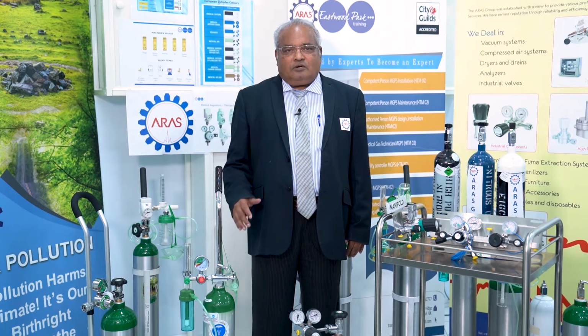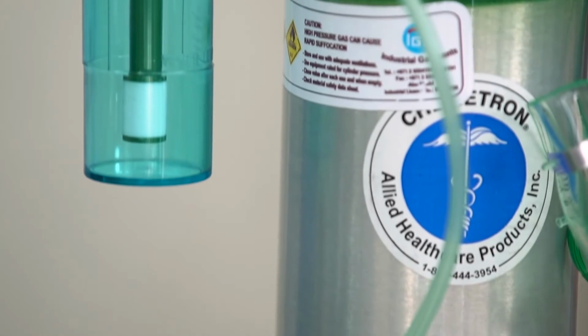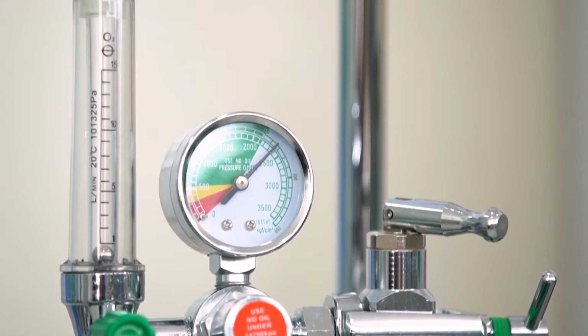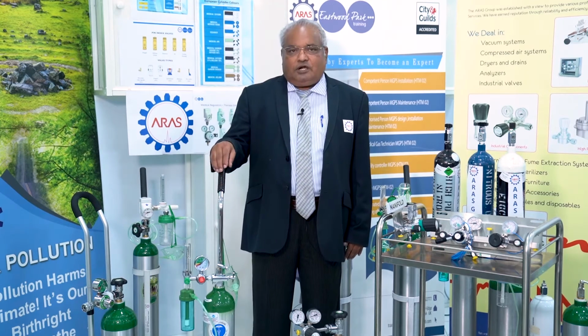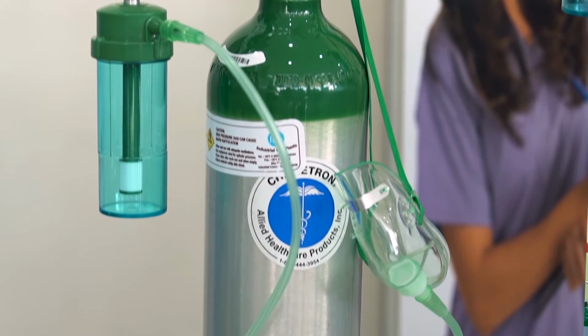Color codes are very important. Here we can see a single stage regulator connected to the cylinder, and it is a pin index. The difference with the pin index is that you can connect only that particular regulator, and only that particular gas. So if it is oxygen, you can connect only oxygen with the pin index.